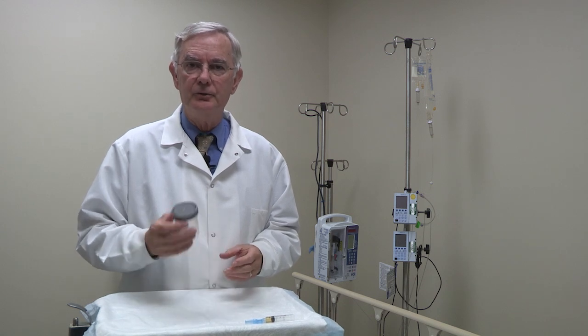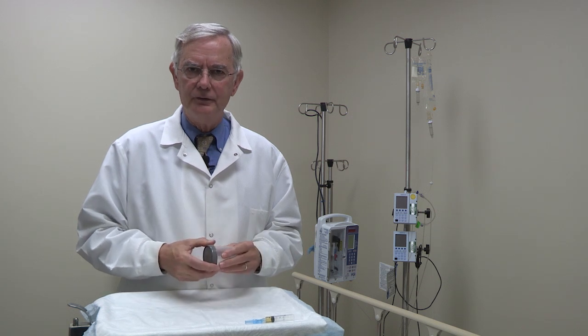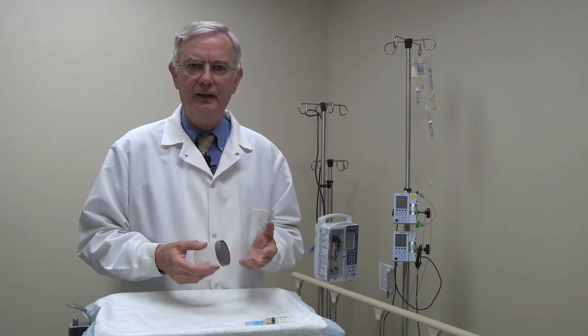For clean catch specimens, be prepared to instruct the patient in a language they can understand. For clean catch, we need a sterile screw-cap specimen container, antibacterial soap, though ordinary soap is acceptable, or commercial preparatory packages, gauze sponges, and rinse water. Explain to the patient what they need to do and hand the patient the cleaning and collecting materials.